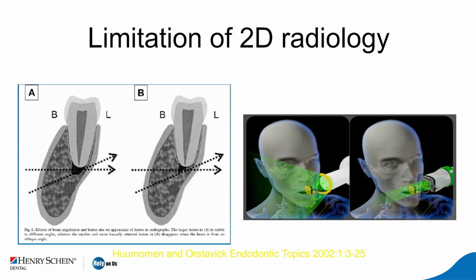So in those indications, let's say you have a patient, you don't see anything that attracts your eyes on the PA that you just took, and he demonstrates atypical symptomatology. Well, it's a good idea to take a small field of view CBCT to assess if there is anything going on. And keep in mind that on 2D, sometimes you'll need a tremendous amount of bone loss before you see a lesion. And it's all about the physics and geometry.